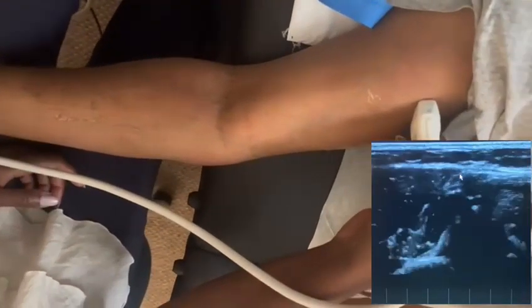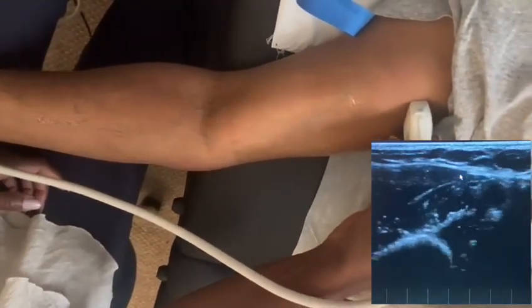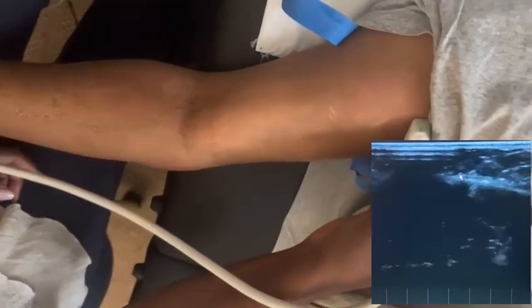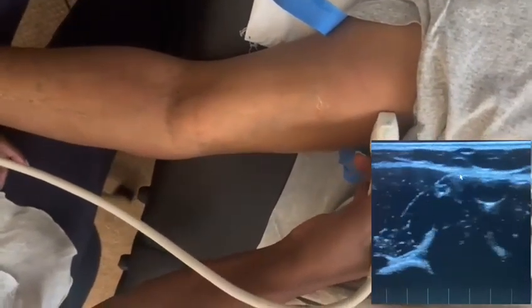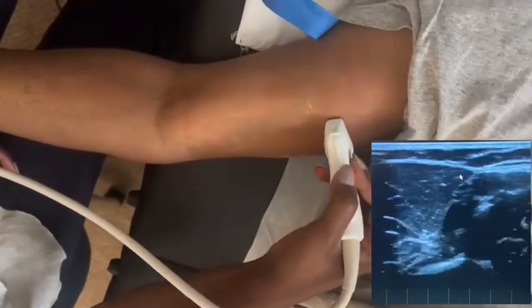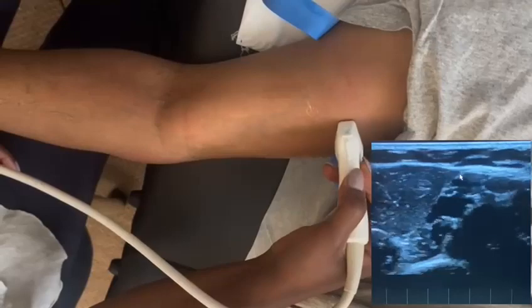Today I'm looking at an upper extremity segment, just right below where the axillary takes off. You can also see my positioning, especially if you're working in a hospital and trying to do this type of study.